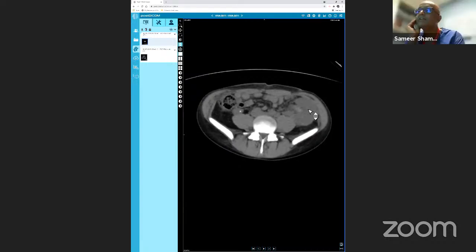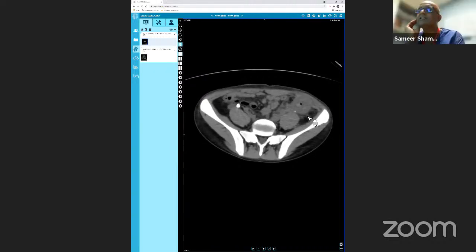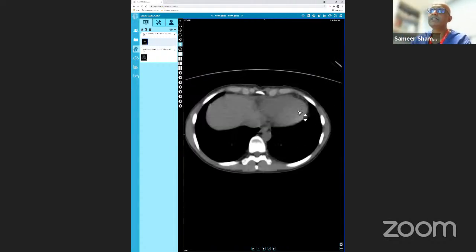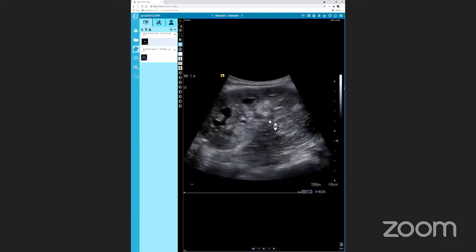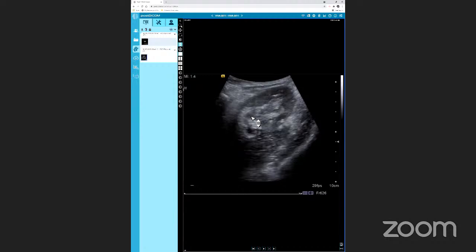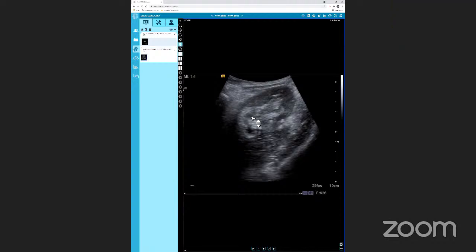Yeah. So it's a renal vein thrombosis. That's something you'd like to exclude in an acute phase. Of course, yeah. Okay, so that's exactly what you were seeing. You were spot on when you looked at the ultrasound. You did see those bright shadows here. So that is all the thrombotic, hyperechogenic material. And when you have gas, it looks like a reverberating artifact on ultrasound. So that's what you are seeing on this scan. So it's renal vein thrombosis in a transplant kidney.